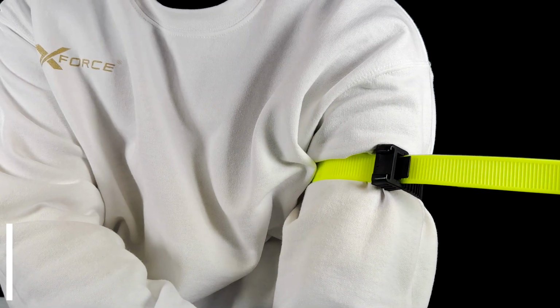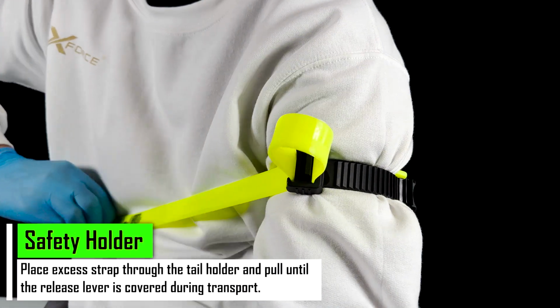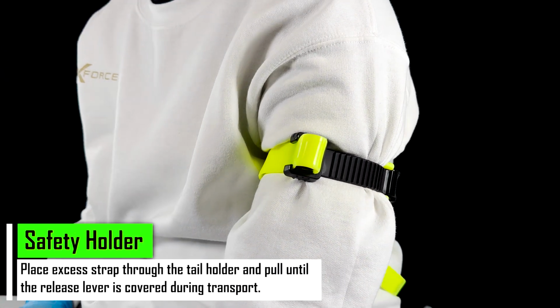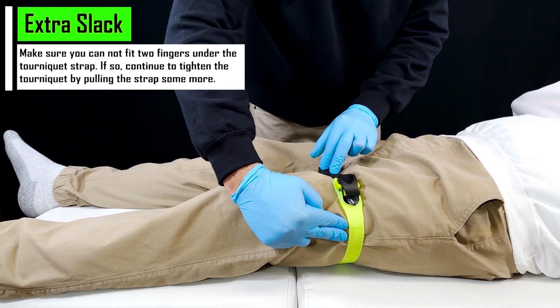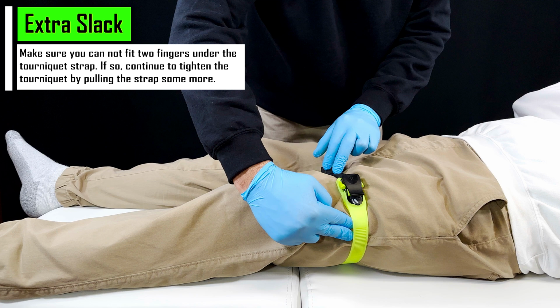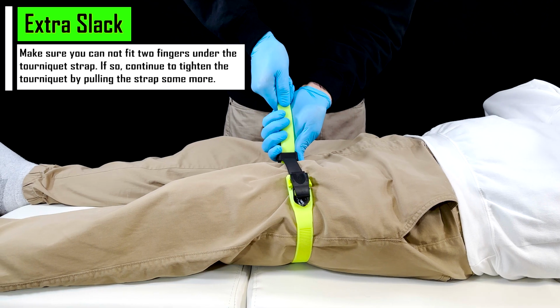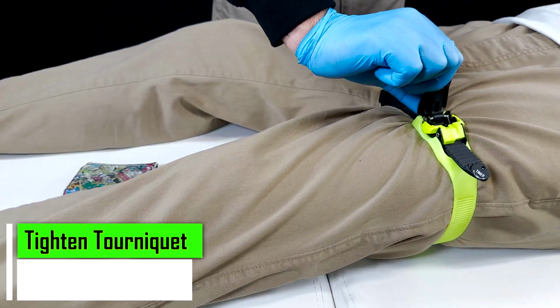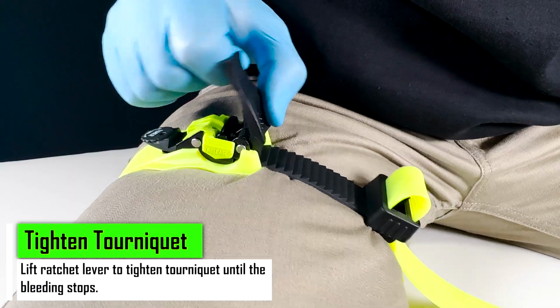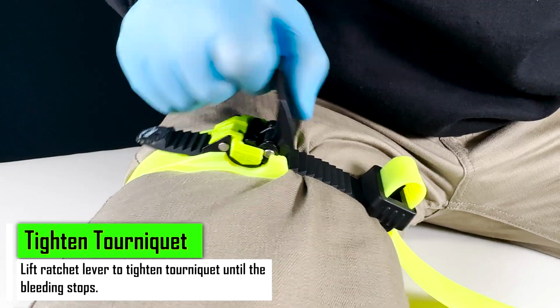Safety holder. Place excess strap through the tail holder and pull until the release lever is covered during transport. Extra slack. Make sure you cannot fit 2 fingers underneath the tourniquet strap. If so, continue to tighten the tourniquet by pulling the strap some more. Tighten tourniquet. Lift ratchet lever to tighten tourniquet until the bleeding stops.